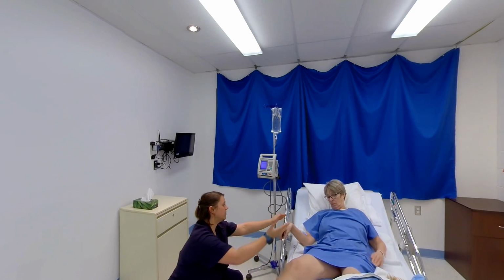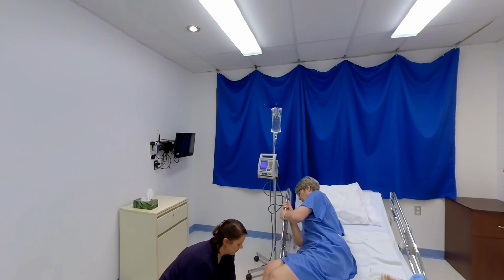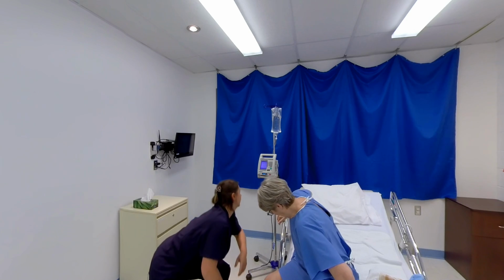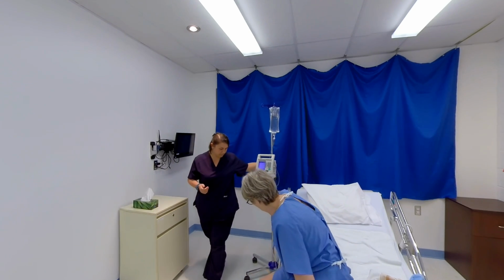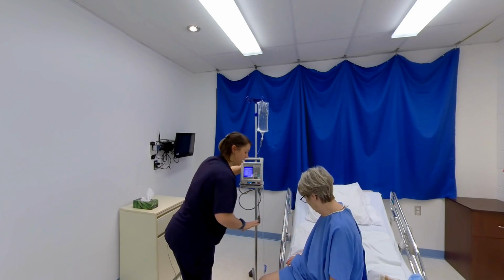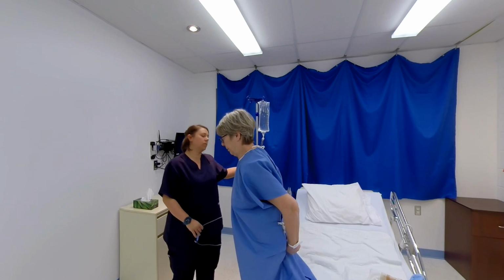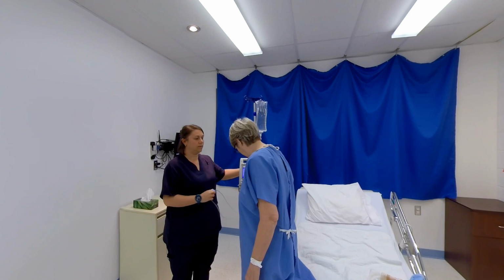Okay. Turn on your side. Turn to your side. Okay. Perfect. One second here. Okay, you're gonna push your hands on the bed to get up, okay? Okay. All right. Get up. Two seconds. All right. Ready to go? Yep.